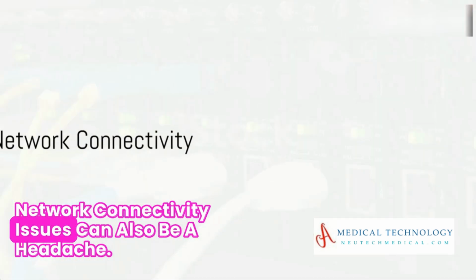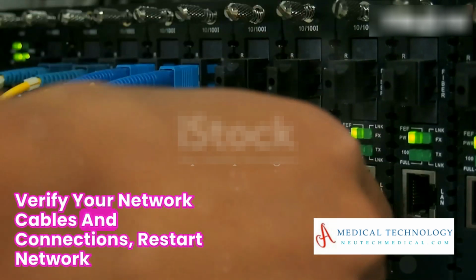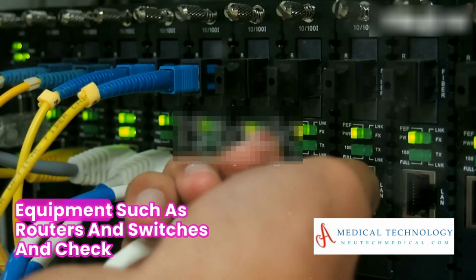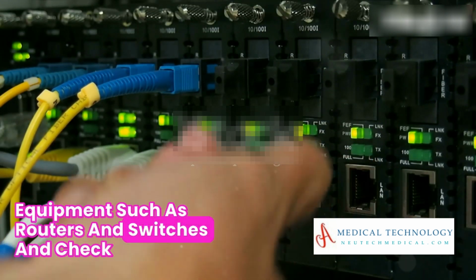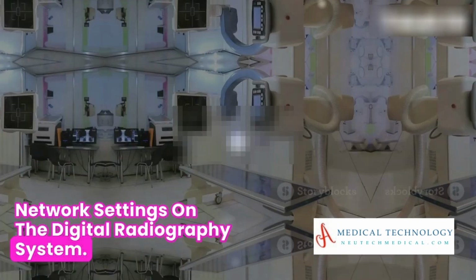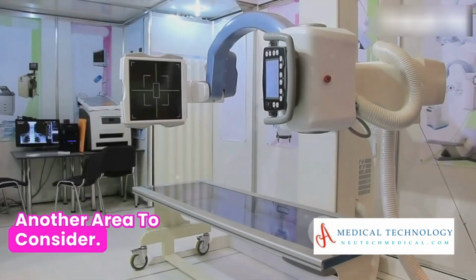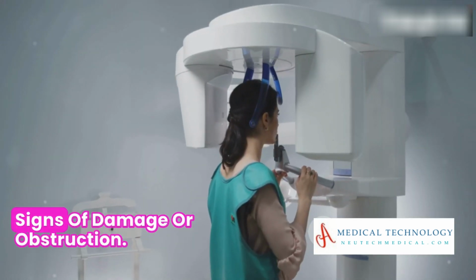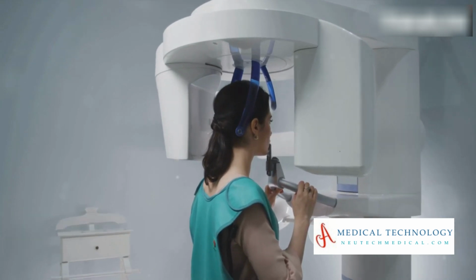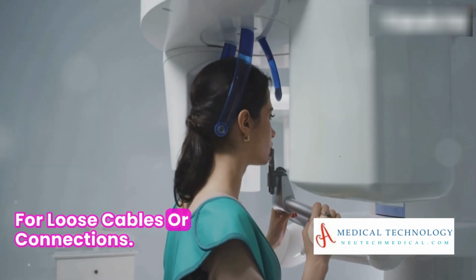Network connectivity issues can also be a headache. Verify your network cables and connections, restart network equipment such as routers and switches, and check network settings on the digital radiography system. Mechanical or hardware problems are another area to consider. Inspect moving parts for any signs of damage or obstruction. Lubricate components if needed and check for loose cables or connections.